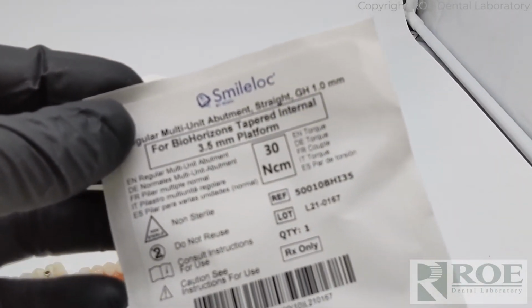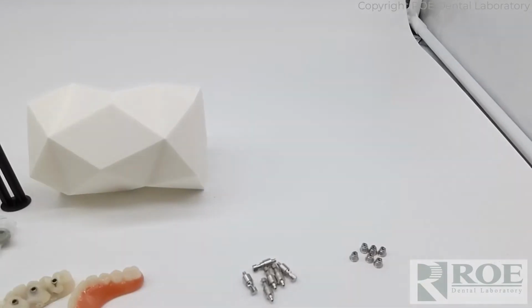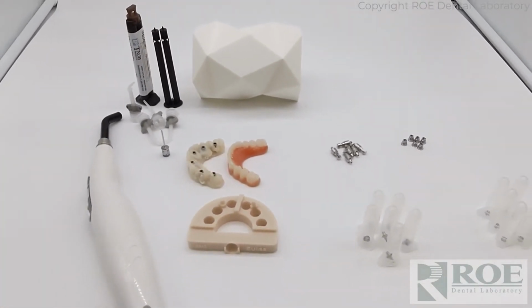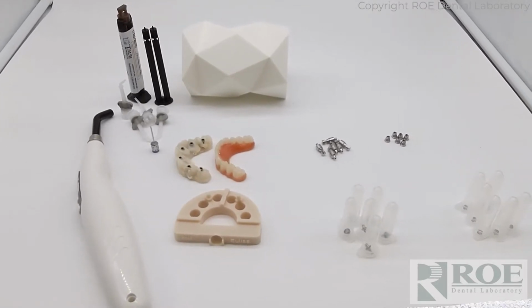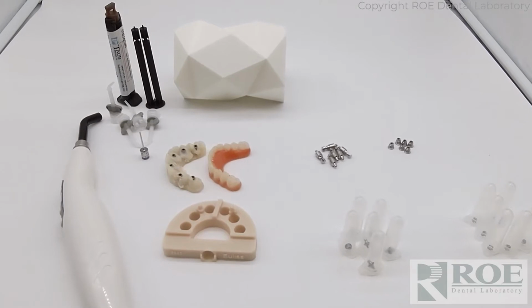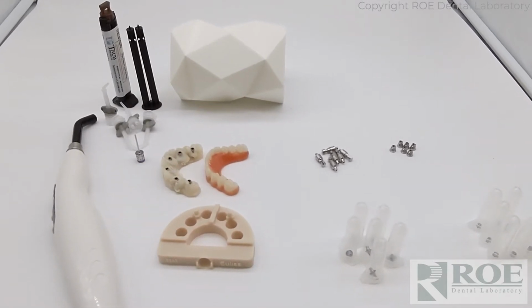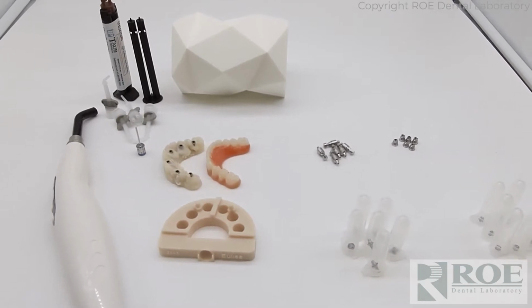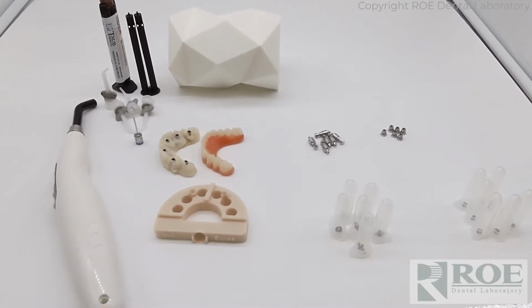And then finally the straight abutments. And in this case, we're just going to use 1 millimeter collar height, but generally you want to use 2 millimeter collar heights for both the angled and the straight, or if the angles are 30 degrees or 17 degrees, then we use the minimum height. 30-degree minimum height is 3 millimeter collar height. So let's start the process of doing the conversion.